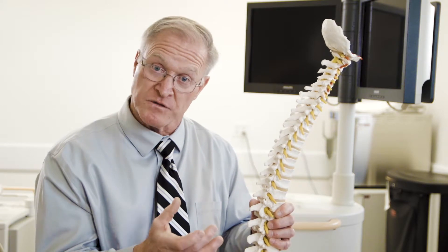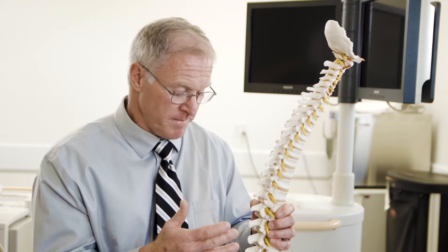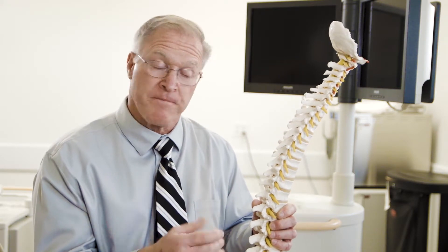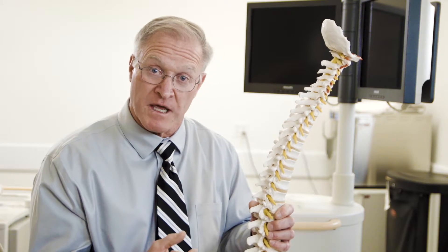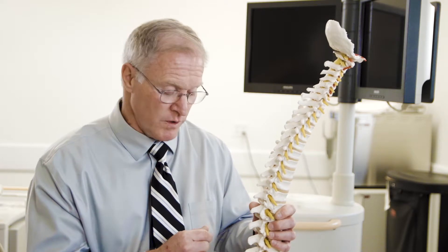90% of the time we get a beautiful picture. Sometimes we don't get it to fill the whole joint, in which case we'll also numb the nerves that go to the joint. But once we've done the arthrogram, we're going to inject a very potent and long-lasting numbing medication mixed with a small amount of steroid into the joint itself, or to the nerve roots that go to the joint.